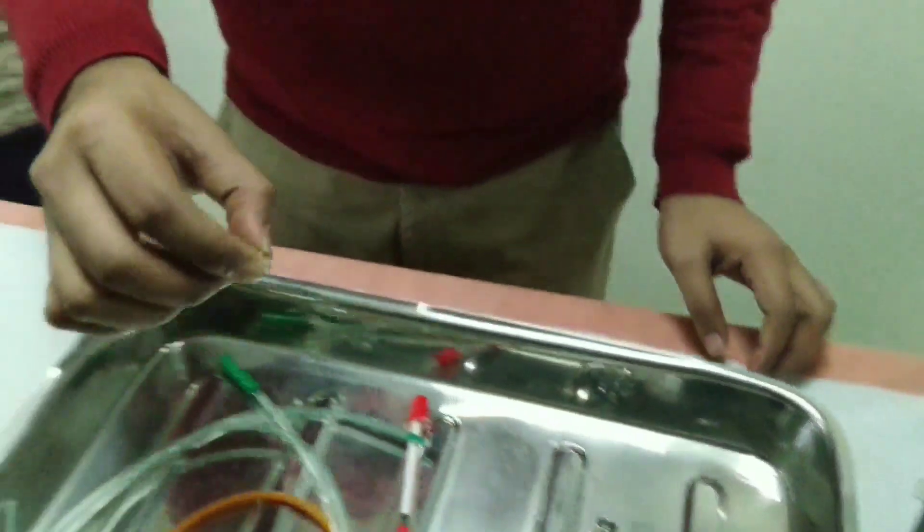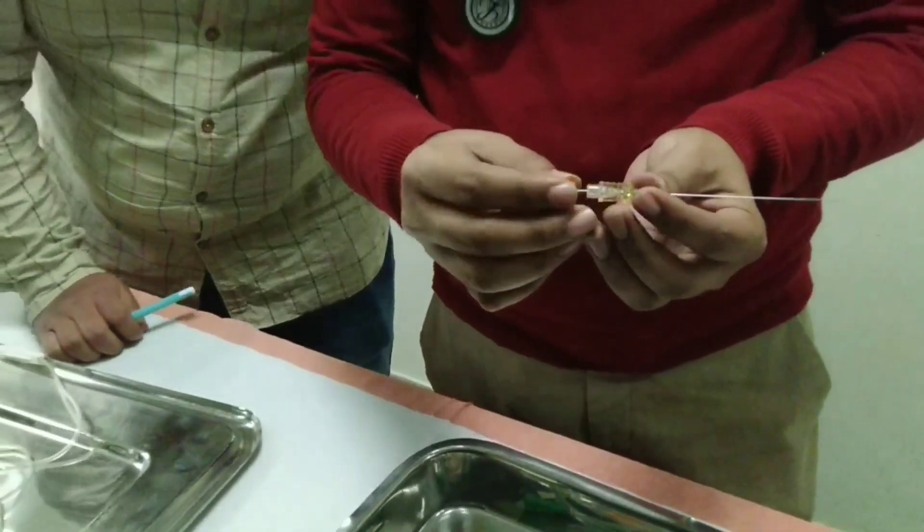This is a lumbar puncture needle. It has two parts: the needle proper and the stylet.